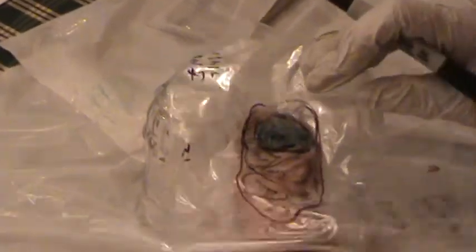And a little trouble with my, there we go, now I got the marker to work. I'm going to double check on my tracing that this is on the right margins, which I see is a better outline here. Okay, so I'm going to measure the surface area of the necrotic tissue.